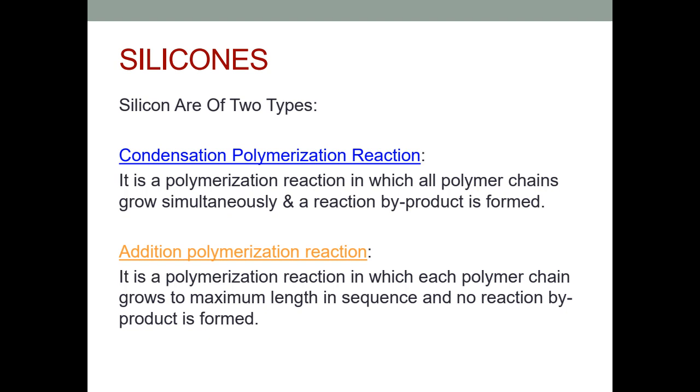As the name suggests, it is because of their reaction. In condensation silicone, the polymerization reaction is in the condensation form; otherwise, it is in the addition form. In the clinic, sometimes there are materials available and you are not able to identify them, or sometimes in a specimen they ask which is condensation silicone or which is addition silicone.